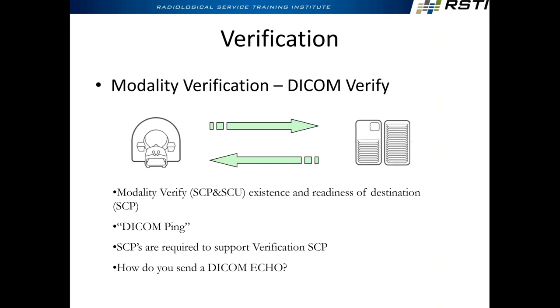Overfull, yeah. What's that? If it's too full already. Could be a storage issue. Yeah. Could be out of memory, or it could be out of hardware storage. That will happen. What's that? Could be something wrong with this specific file. Absolutely. Anything else? Yeah, those are all great reasons. Something wrong in the actual data.